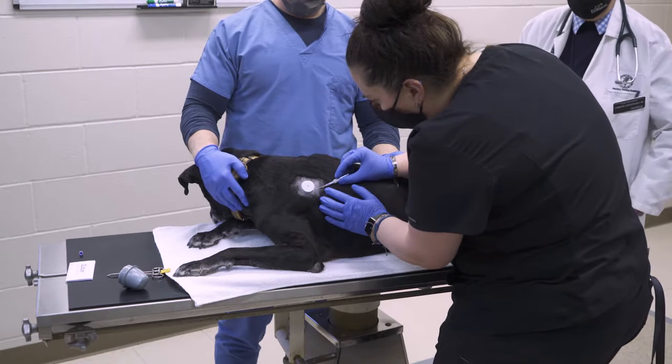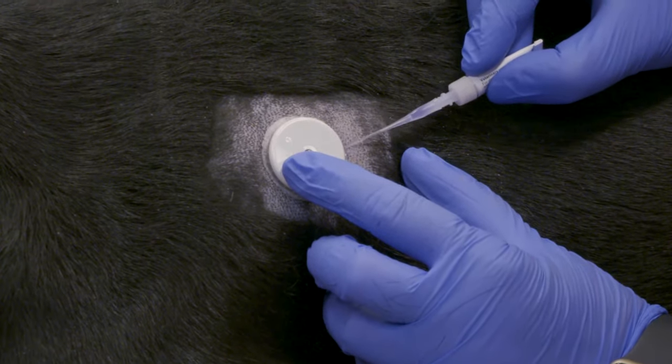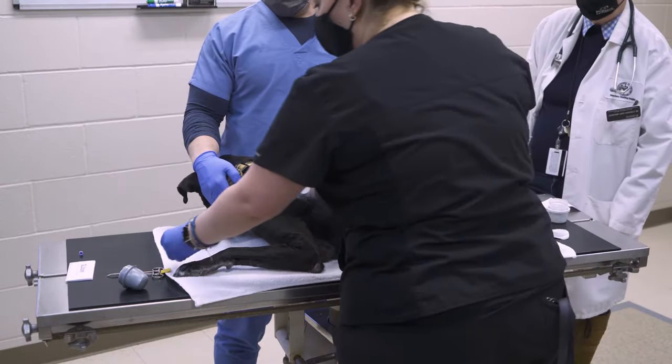Once the applicator has been removed, push down firmly on the edges of the sensor to make sure it is completely adhered to the skin. Sometimes it may be necessary to add additional tissue glue.